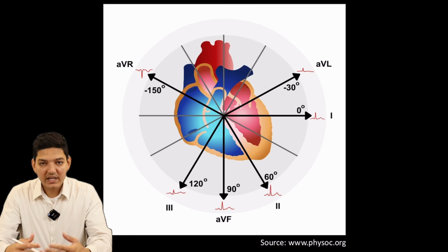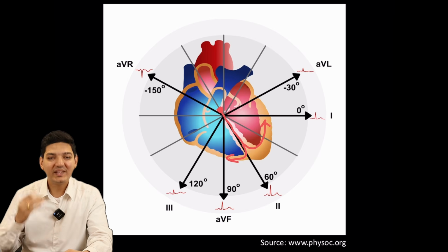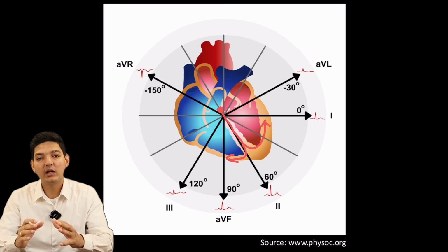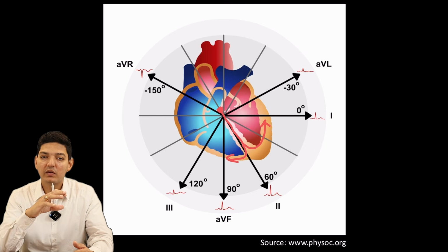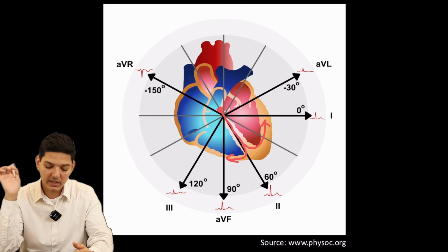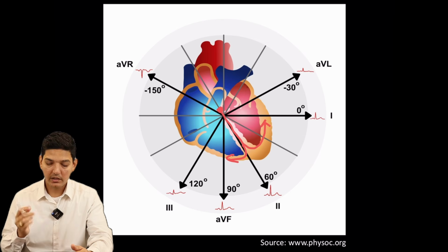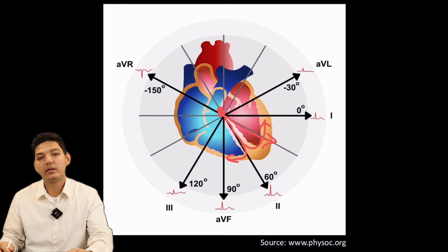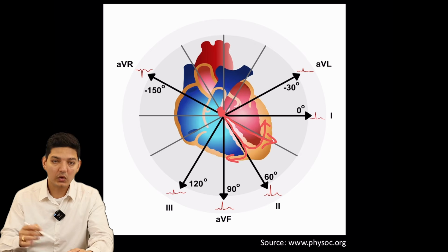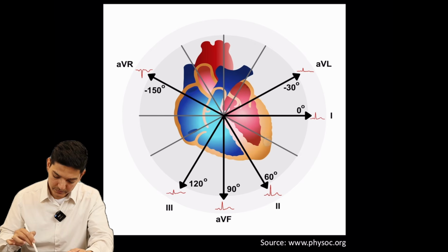Now let's try to understand the vector for the ventricles. When it's moving from the AV node towards the left and right, one thing we need to understand is that the left ventricle forms the majority of the chunk of the ventricle. The myocardium is thick and the majority of the electrical current flows towards the left ventricle. So the direction of the vector is mostly directed towards the left ventricle. This is something you need to understand to know why the QRS looks the way it looks.